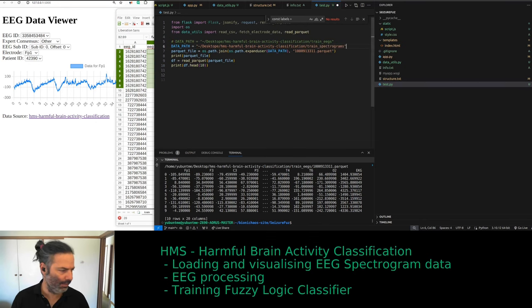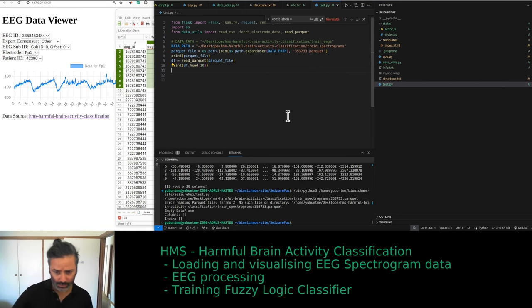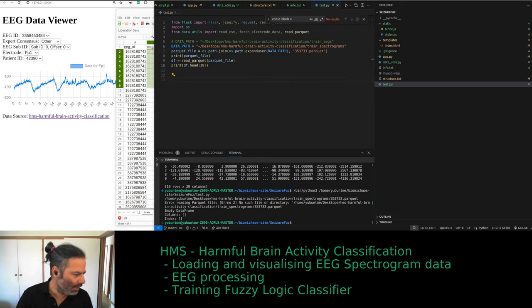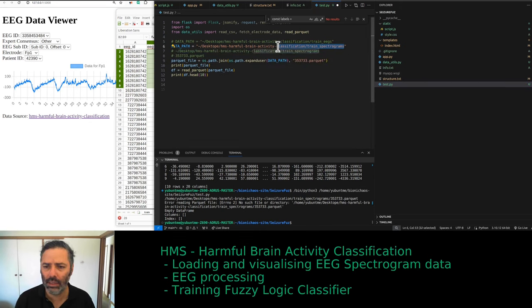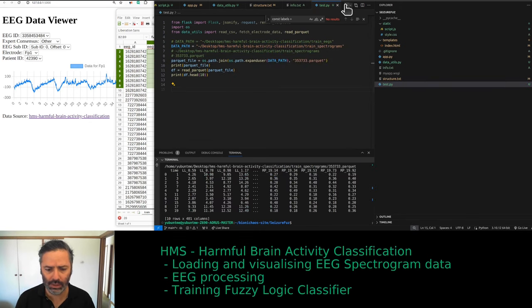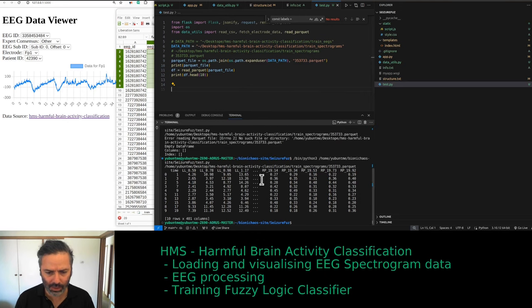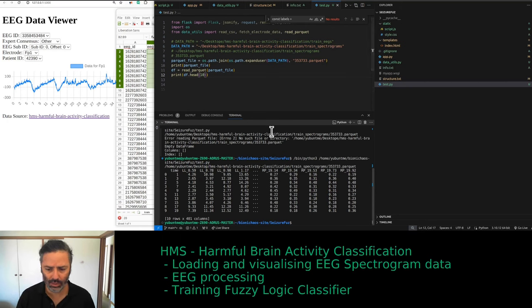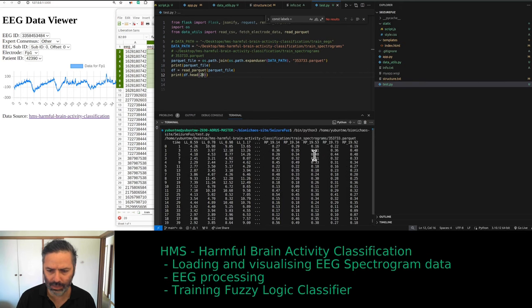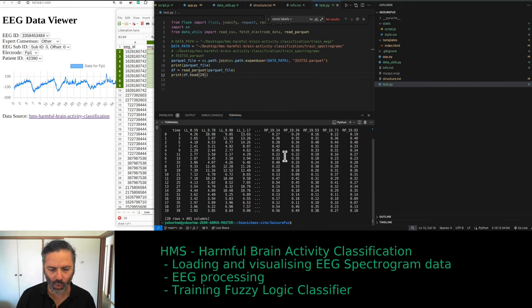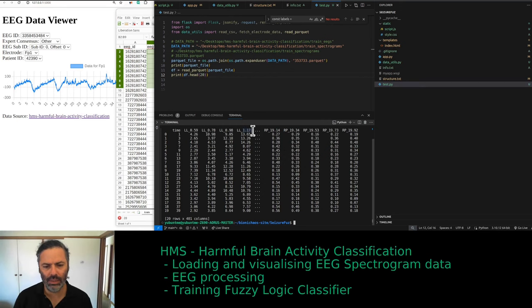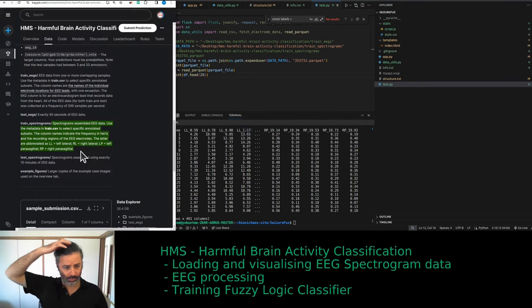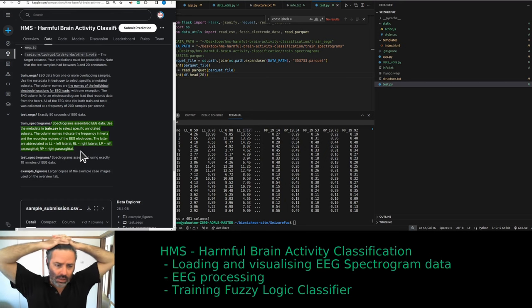Loading one of those files — had a typo causing a 'no such file' error. Let's try it again. Now loading 10 rows — that's what we're loading. Load 20 doesn't matter. What does matter is we have 400 columns — that would be the frequency.